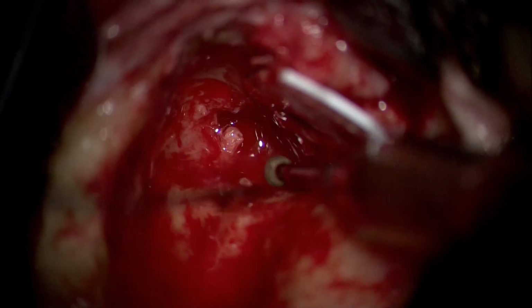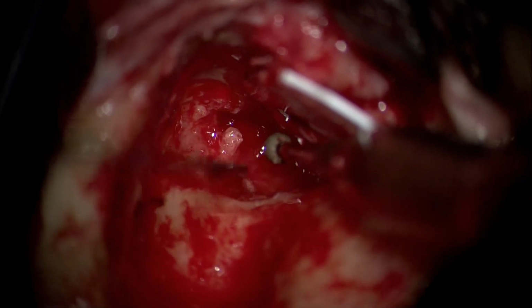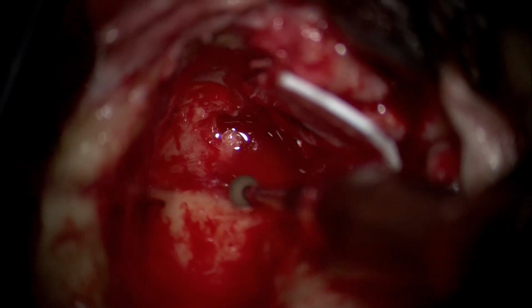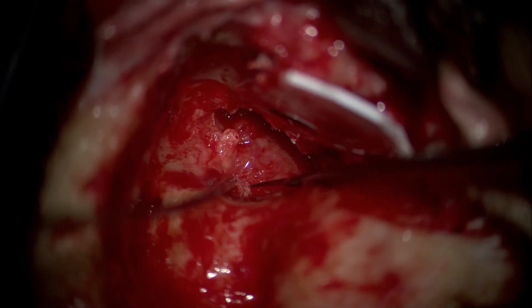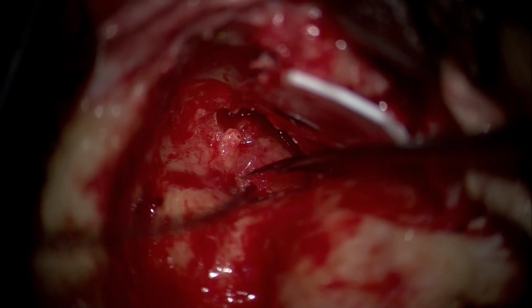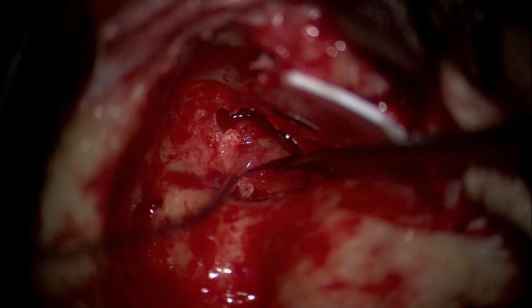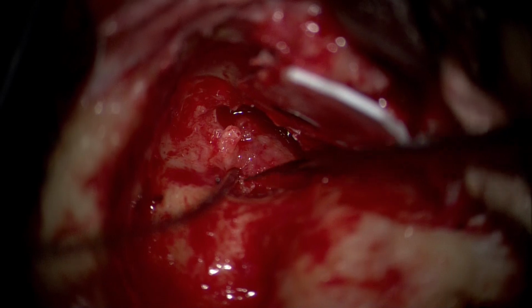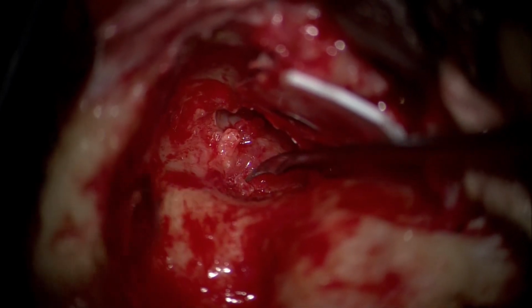So adequate irrigation is important in this step. You don't want to be overheating, but you also don't want to flood the surgical cavity, because then that would limit your vision. Using a small diamond burr in this situation, and once your exposure is progressively increased, you come back again to clearance of disease from the stapes head till the time you start seeing bare bone on the stapes head and the superstructure.